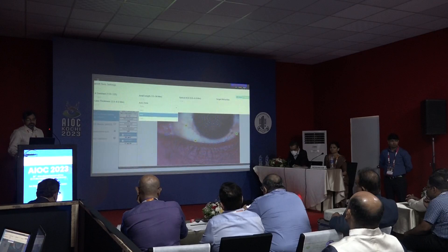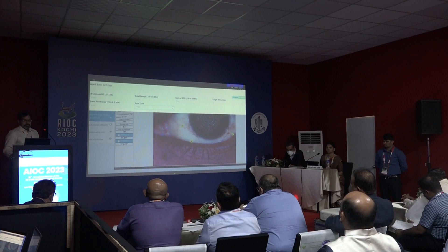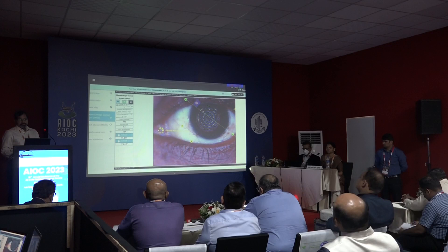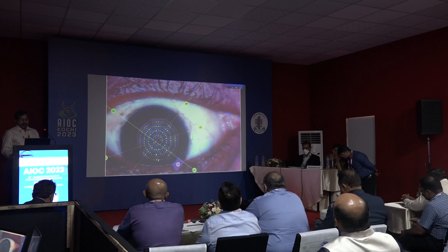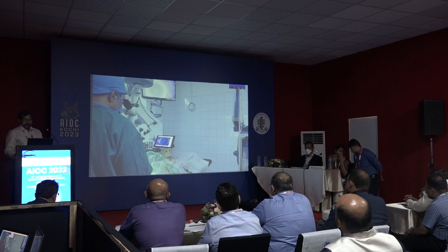Press the pencil icon to enter biometry data — axial length, ACD, and lens thickness. The axis of alignment at 147 degrees is displayed as a green line, and the site of incision at 136 degrees is shown as a pink highlighted area. Identify two prominent limbal structures and click on them — the system displays their axis, which is 17 and 50 degrees in this case. Save the picture, rotate it as needed, and use it intraoperatively to identify landmark points under the microscope.